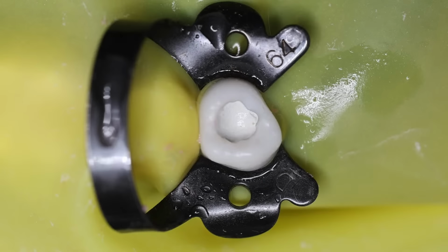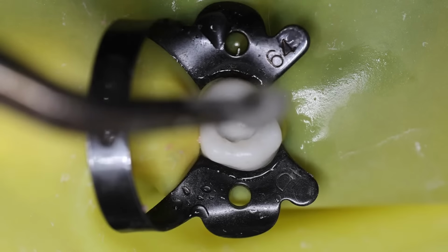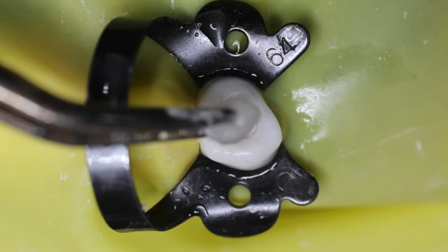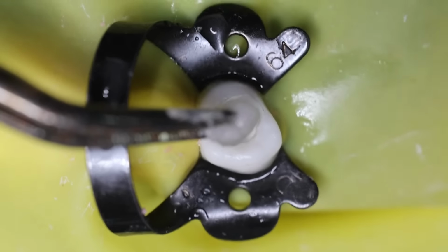Okay, now after the condensation is achieved, you can have a moist cotton again. So I am placing this moist cotton. See this cotton, it is moist.